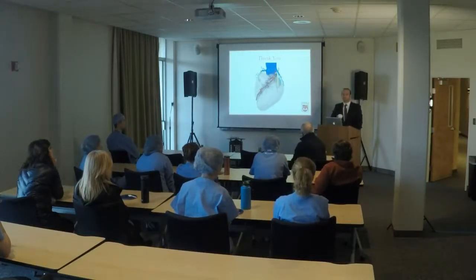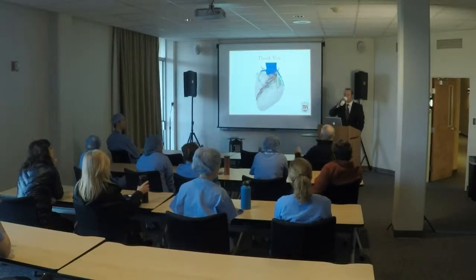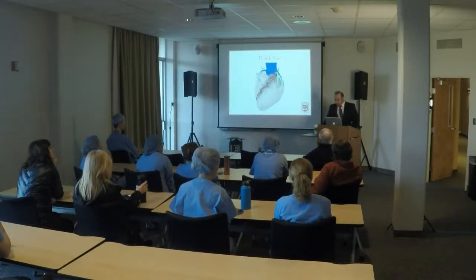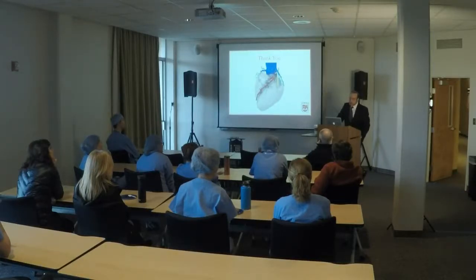And then how about calcium in terms of ability to interpret the severity of the stenosis in the setting of moderate to severe or diffuse calcium? Yeah, so that's a great question. Yeah, you've got great questions. Yeah, so the calcium is problematic. It is an Achilles heel of CT. And multiple studies would suggest that we overestimate stenosis with the calcium because there are these artifacts called blooming artifacts that can occur with calcium in the setting of a CT scan that can make stenosis look worse than it actually is. So it can be problematic.